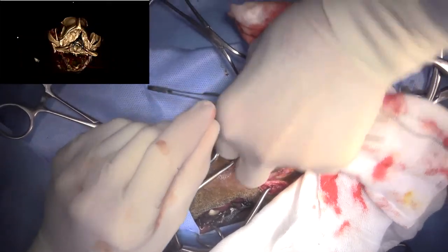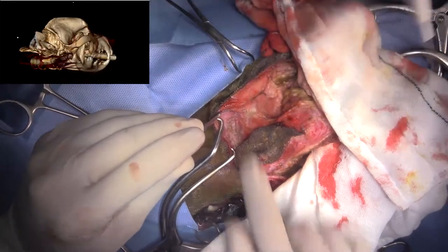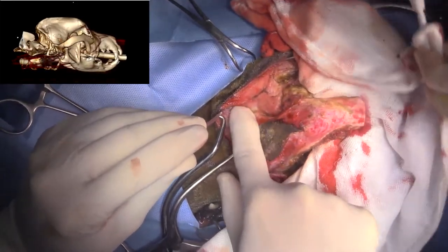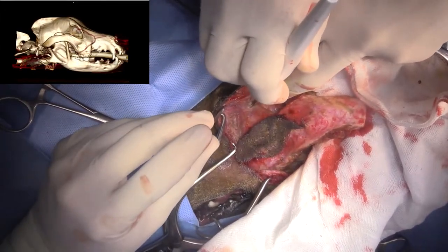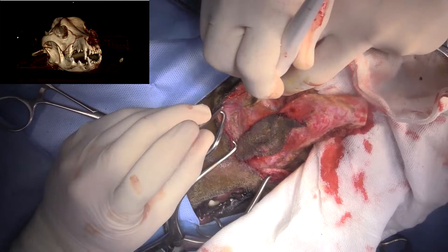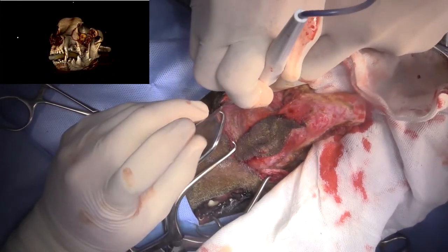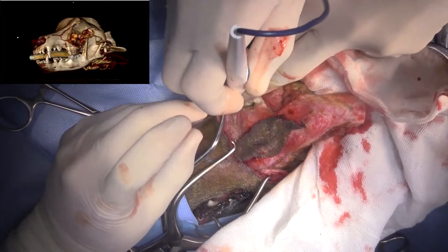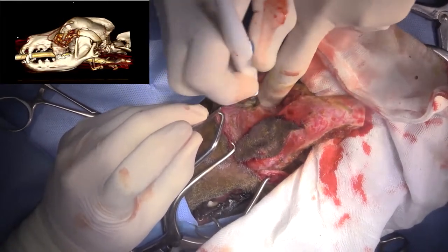So what is that there? That's where the medial canthus is. Feel how attached the medial canthus is. The soft tissue is attached to the skull. And will the vision be affected? So we might get double vision. I don't know how we could tell. We couldn't read the newspaper anymore.